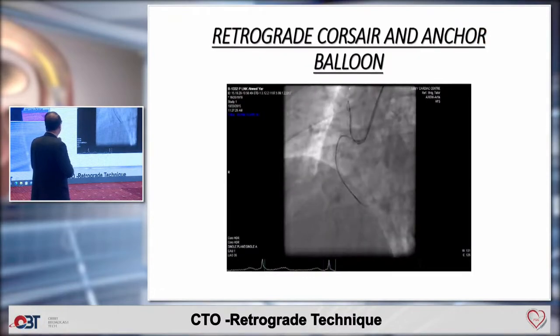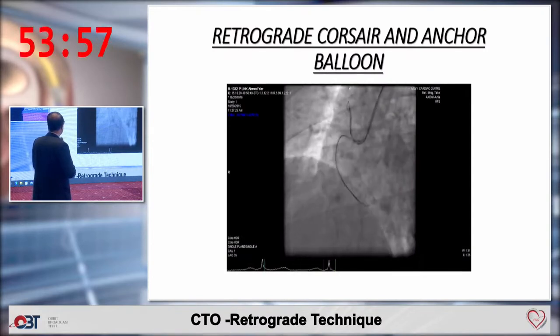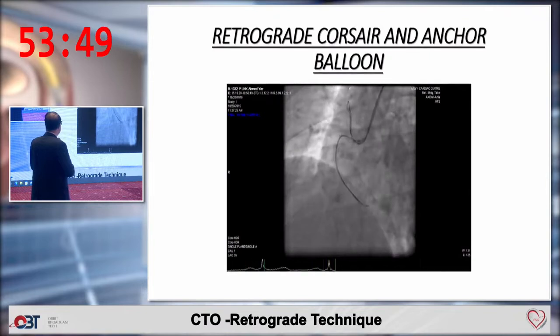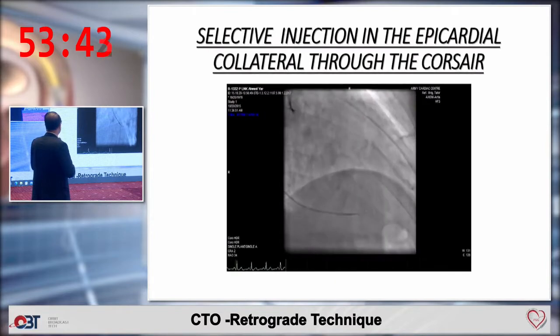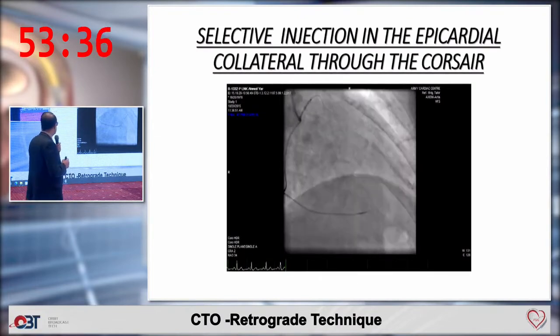So we are using a 7 French guiding, which is a Judkins. We are using a balloon in the conus branch to increase support. This is a Corsair catheter. Next, we entered the collateral channel with the microcatheter and gave a tip injection.